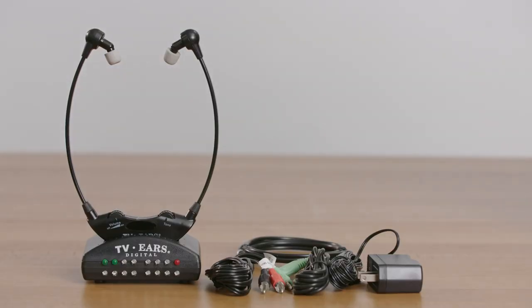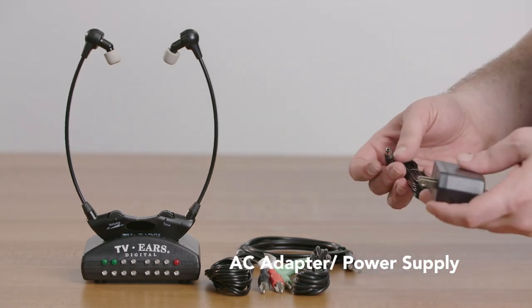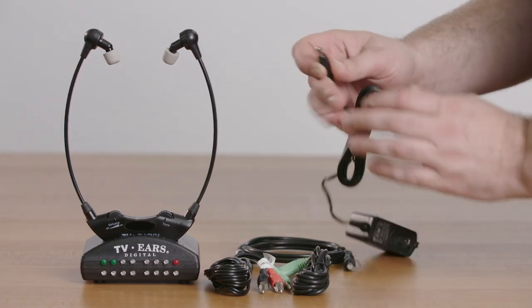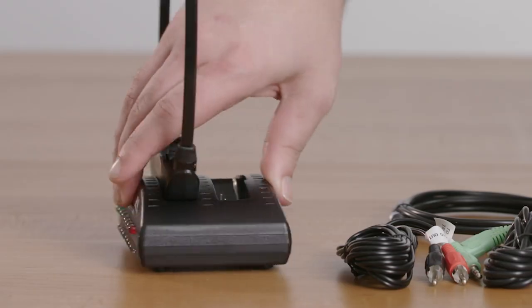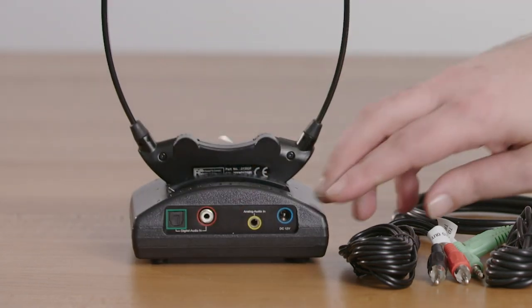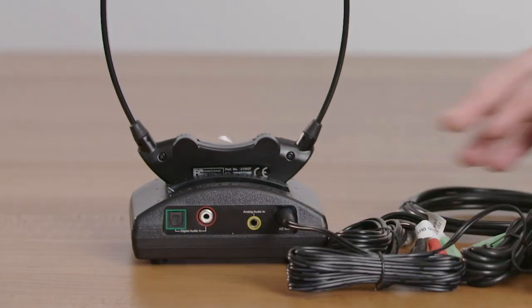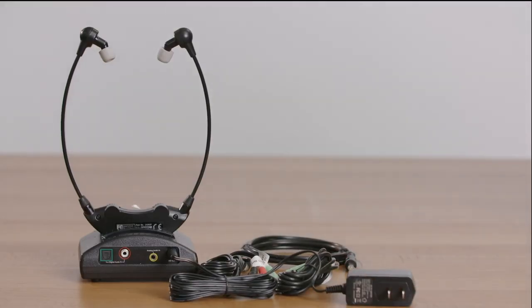To install the system, the first thing we need to do is get electricity for the transmitter. We start by using the AC adapter — plug one end into the electrical outlet and the other into the back of the transmitter. On the back of the transmitter, go into the far right blue hole, the DC12V port. Once that's connected to electricity, we can plug it into the TV.